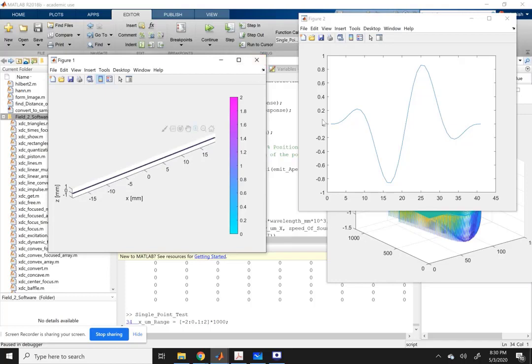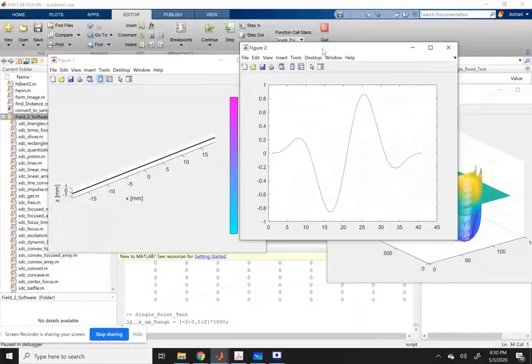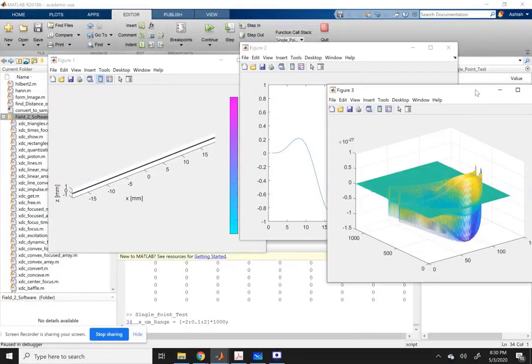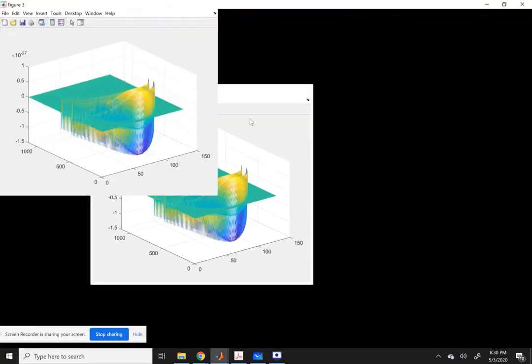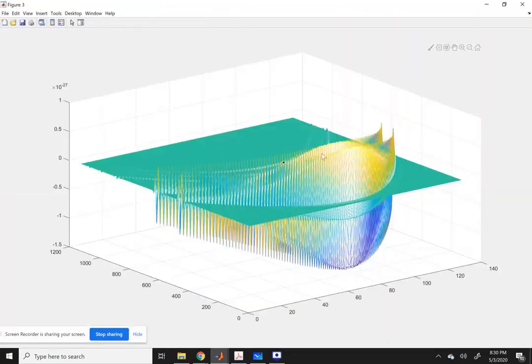After that, each of these elements has been assigned an impulse response which is like this. This is the Gaussian modulated sine wave which has been assigned as an impulse response to each of these transducers. When all of these transducers are fired together, the signal received by each of them is given by this. You can see on this axis there are 128 elements, and on this axis is the RF data for each of the 128 elements. Let me rotate it.